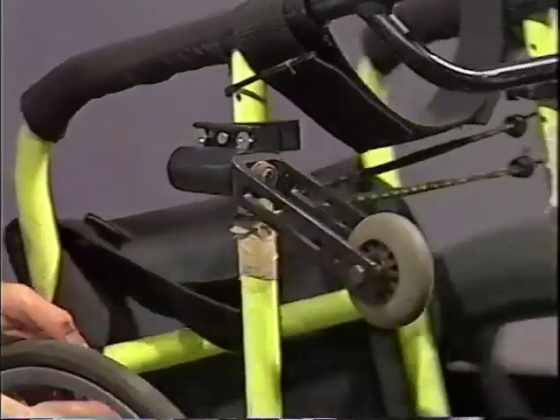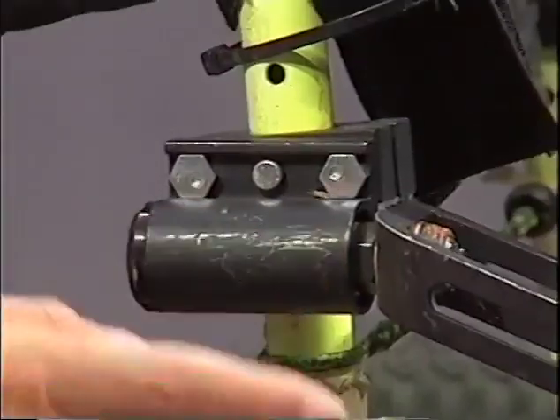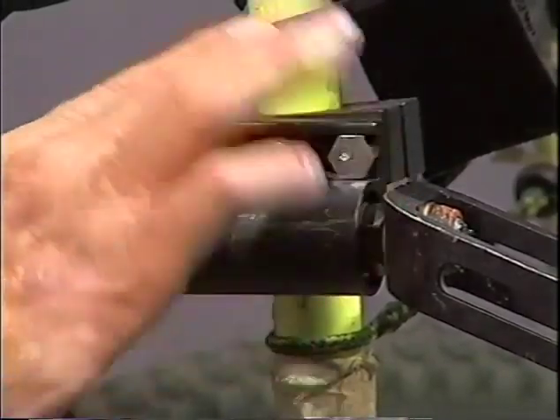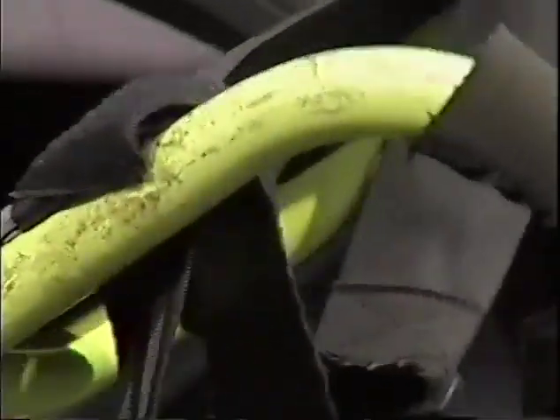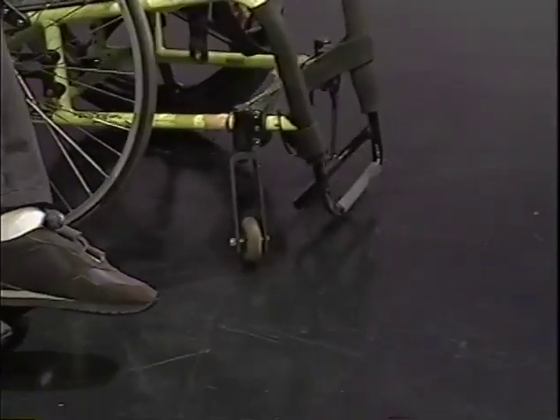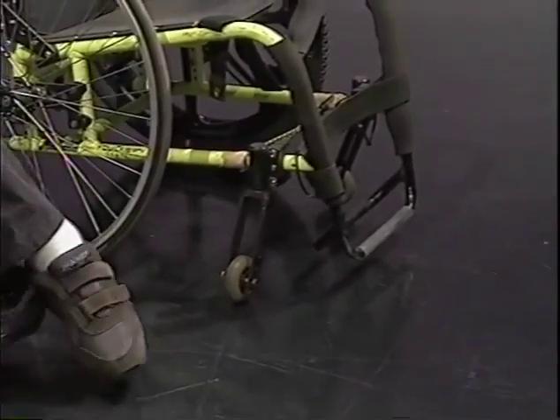The other thing that you want to consider when setting up the front end is to get this perpendicular to the floor. You do that simply by adjusting these bolts. These are eccentric cam bolts that can move and tilt this front end forward and backwards. And when you get it level to the floor, you can see that the fork stem is 90 degrees to the floor. That's really what you want, so that it will turn and swivel very easily in any direction and doesn't have to lift the front end up or down.